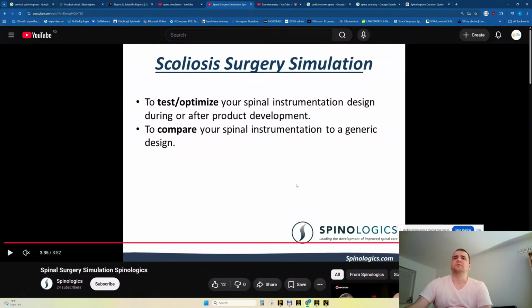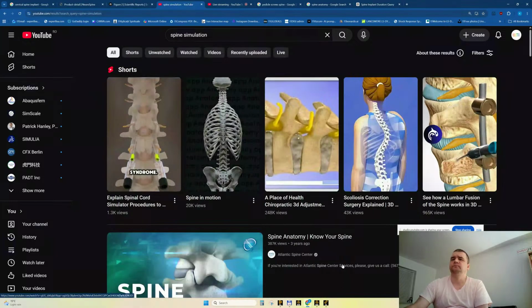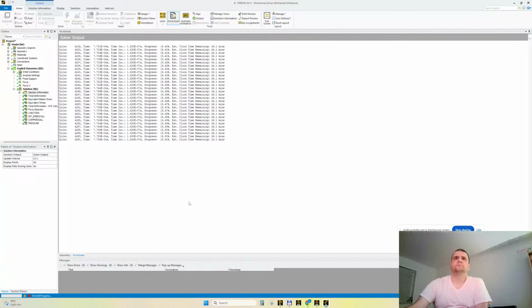Nice work. Could have been finer. I mean, the mesh could be finer. Nice work. So from 25 minutes, we have 26. We're on the right track. I think the time is going in reverse.